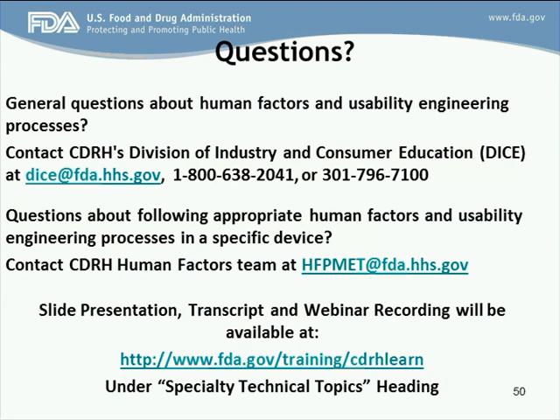Okay, it's not necessarily a change in terminology. It's a synonymous term. The terms commonly used in the industry include human factors validation, human factors summative validation, usability validation, usability summative. We hear a lot of terms as we review these submissions. What we're getting at is the crux of that final evaluation of the user interface in a simulated use type scenario. So as we're referring to human factors validation or human factors summative validation, those are really synonymous terms. Okay, thank you.